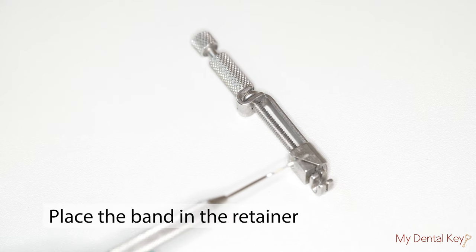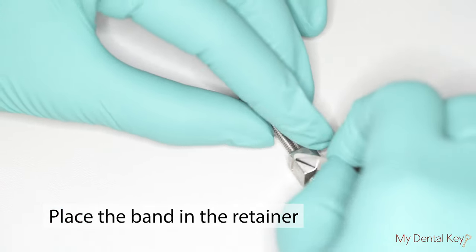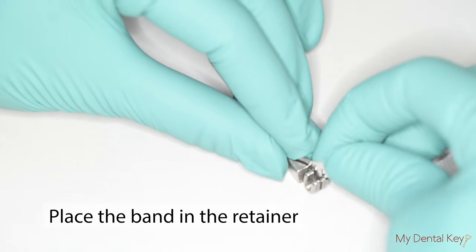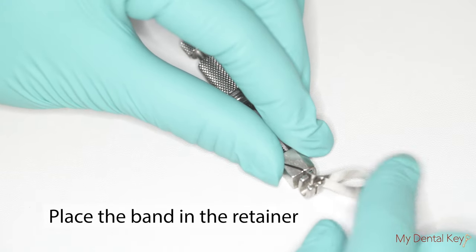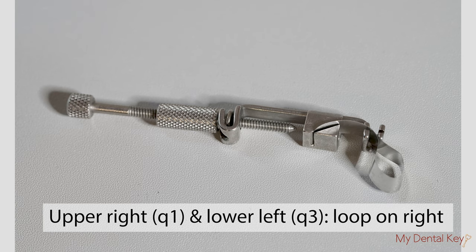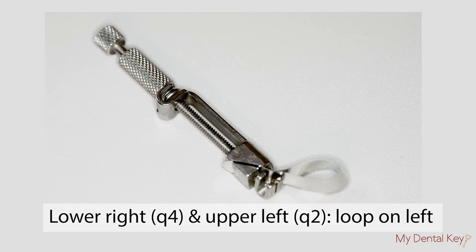Hold the retainer so that the slot on the head faces upward. Slip the two ends of the looped matrix through the diagonal slot on the vise of the retainer. Depending on the quadrant, the loop will come out of the right or left side of the diagonal slots on the vise. If working on the upper right quadrant, the loop will come out of the slots located on the right side. If working on the lower right or upper left quadrant, the loop will come out on the left.